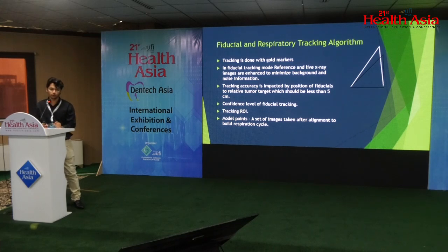One of the most important parts in the position of these gold markers is that they have to be in close proximity to the tumor, so that we are sure that as long as the tumor moves, the marker moves in sync with the tumor. Confidence level in fiducial tracking: it is the level of confidence of how sure the robot itself is that it is completely giving the dose to the tumor.